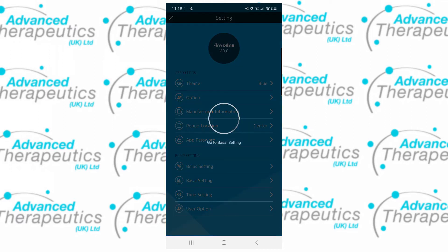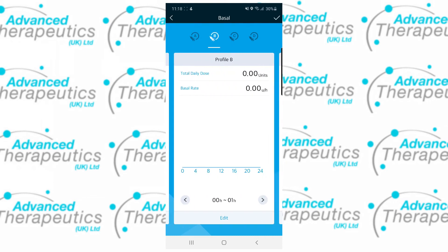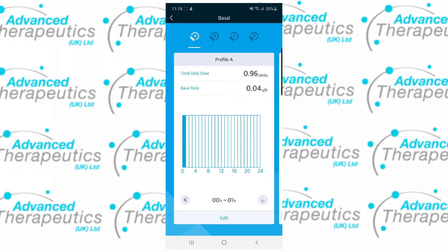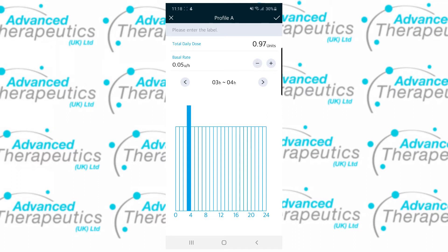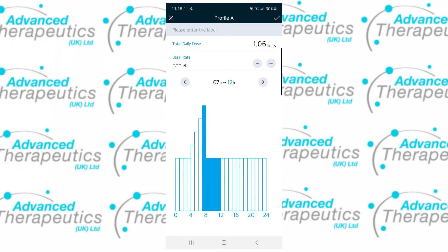You can also get access to your basal settings from this menu. Here you can see your basal rate profiles, swap between them and edit them. You can also view the basal rate profile hour by hour. Tapping edit will go through to a new screen allowing you to make changes to your basal rates. You can do this hourly, or by tapping on the numbers you may select multiple hour blocks and make larger changes all at once.